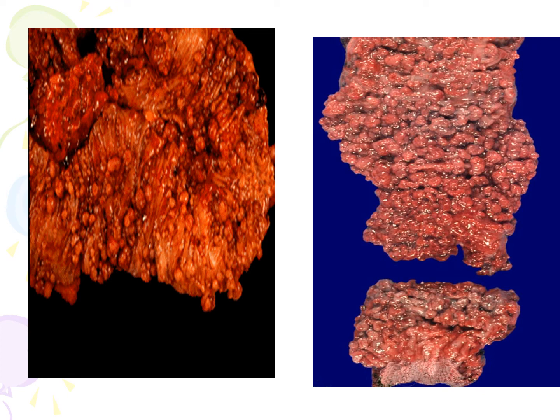This is familial adenomatous polyposis in a patient who had an APC gene mutation. The mucosal surface of the colon is a carpet of small polyps. The inheritance in FAP occurs in an autosomal dominant fashion, and the risk of development of adenocarcinoma is 100% without treatment. So, total colectomy is usually done before the age of 20.